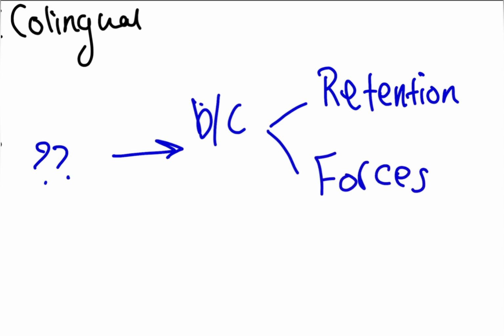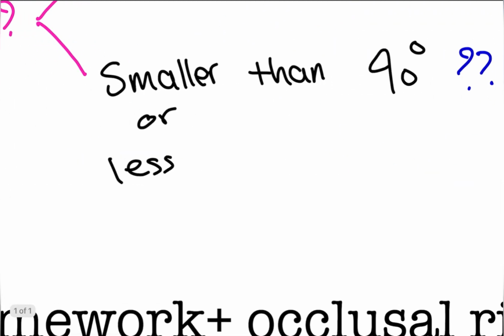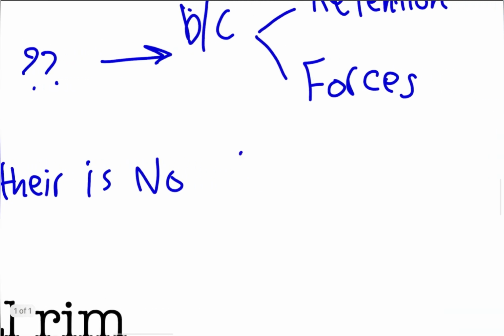So if they ask you in the exam, these are the reasons. Because of this inclination, forces are directed as axially as possible. There are no torque forces.